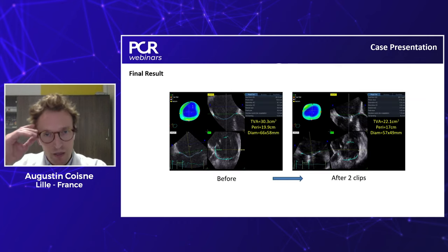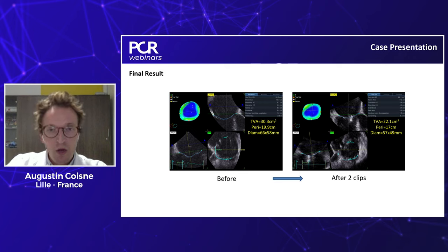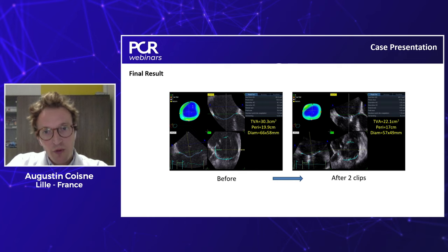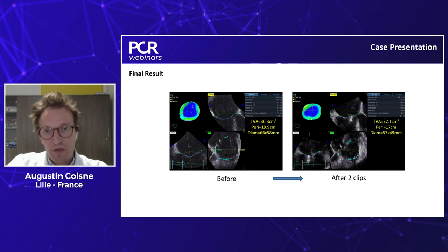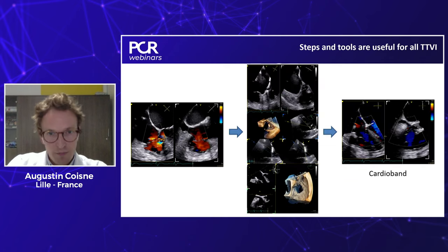We checked the final result in transgastric view — 2D and with and without 3D and color — and were very happy with the grasping of the leaflets. The final result showed a good reduction of TR severity with one clip in the middle and two clips. We also observed a significant reduction in tricuspid annulus dilation: the tricuspid valve area decreased from 30 to 22, and the perimeter decreased from 20 to 17. So there was a meaningful impact on the tricuspid annulus as well.